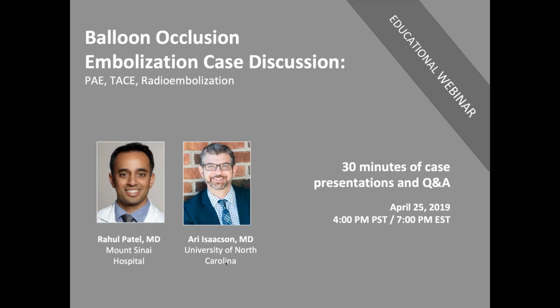Myself and Dr. Rahul Patel are going to show you some cases in which we use a balloon occlusion microcatheter. We're going to show you some PAE, TACE, and radioembolization. The order of events is I'm going to go first and show a couple PAE cases, and then I'm going to turn it over to Rahul, and he is going to do the IO cases. We'll have an opportunity in between to ask some questions, and then at the end we'll have another opportunity to ask some questions. With that, let's get started.